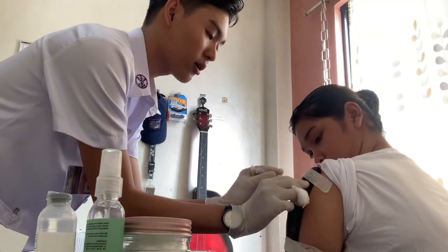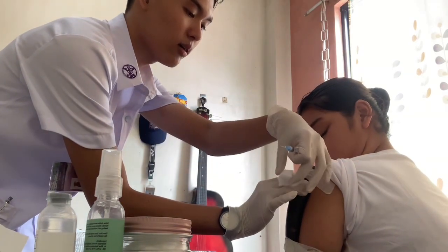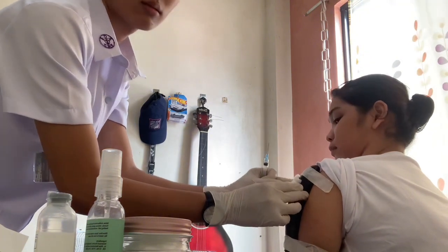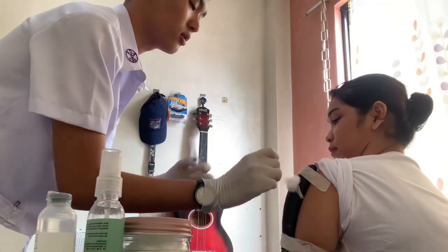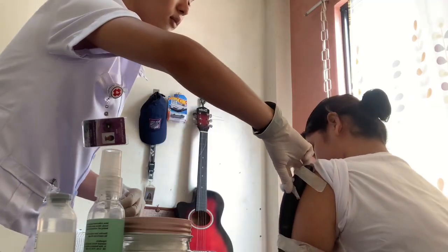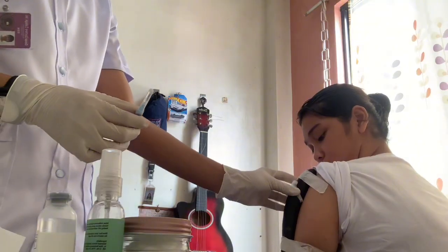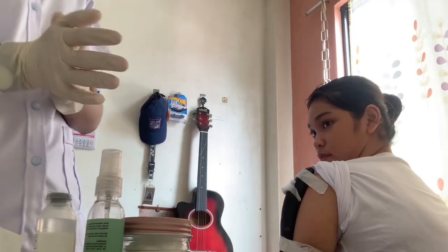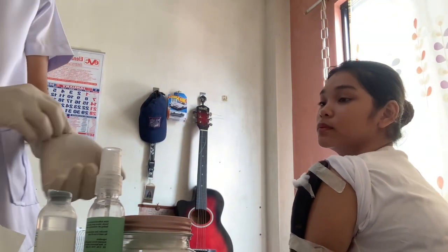Now, remove the needle smoothly and put this. Then, remember, it is not necessary to massage the area after the injection. So, dispose the used syringe, and what I'm going to do next is to assess the patient.